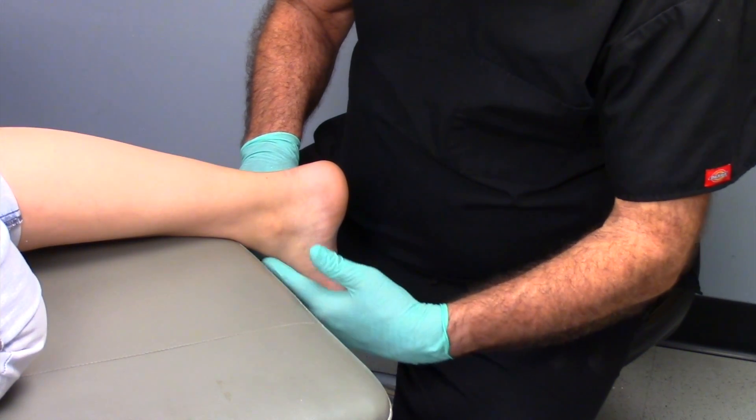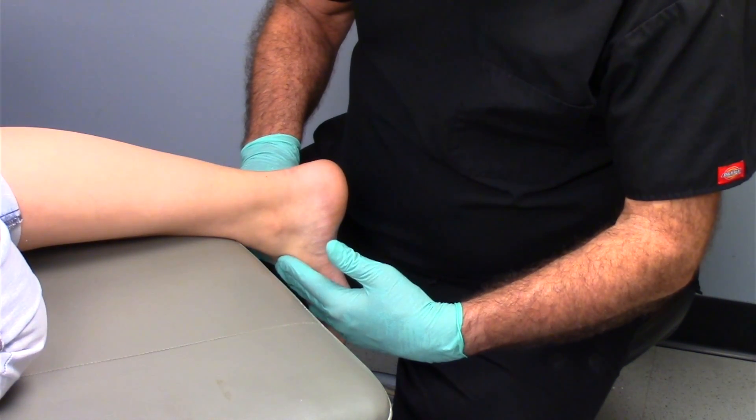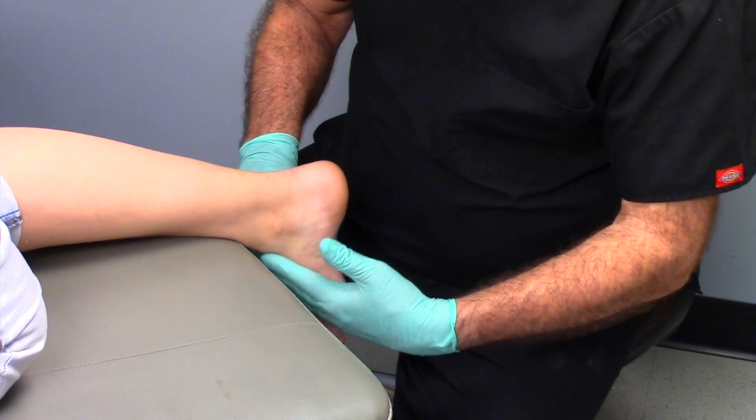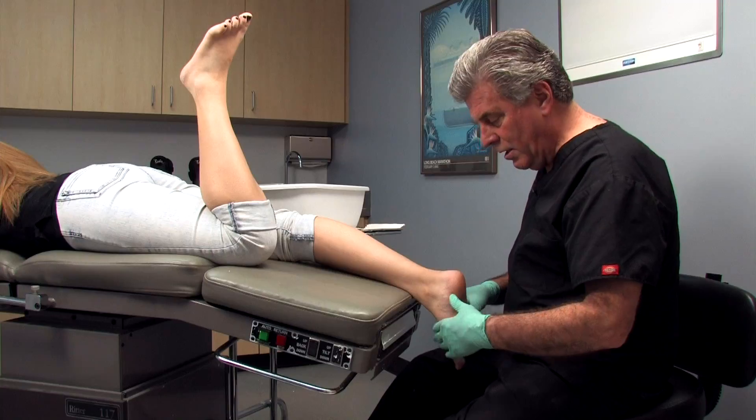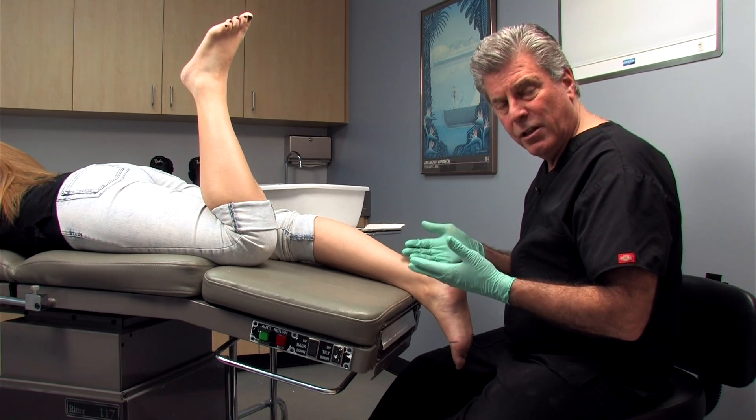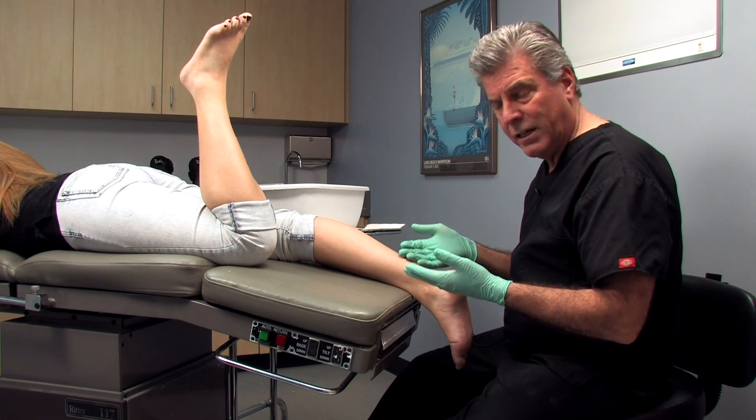You have to feel along there and make sure you don't feel that tendon bowstringing. If it is, you've got to get the patient to relax and try to reduce that supination. Otherwise, the technique is pretty similar to what we do with the supine technique.